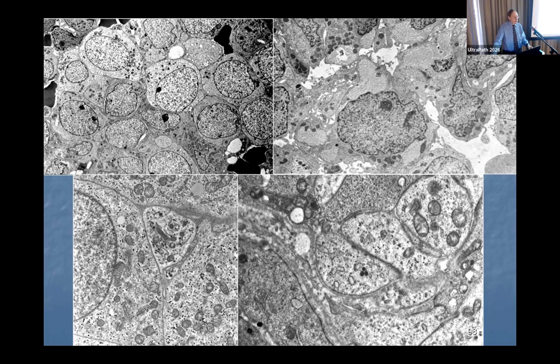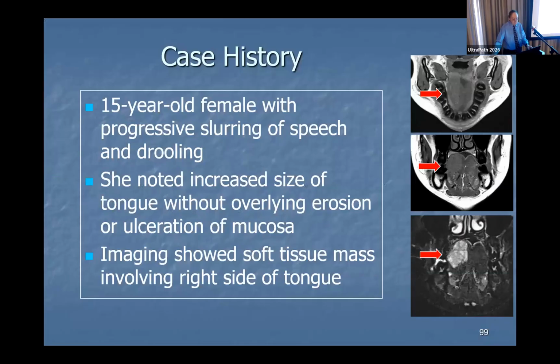And the lower panel shows some neurites that can occur as you go from undifferentiated Ewing sarcoma to atypical Ewing sarcoma, when you start picking up neuromarkers, to the place where you have the primitive neuroectodermal tumor of soft tissues, which can have neurites and may have neurosecretory granules. A lot of Ewing sarcoma, even the undifferentiated form, will have neurosecretory granules, as you saw in this particular case.